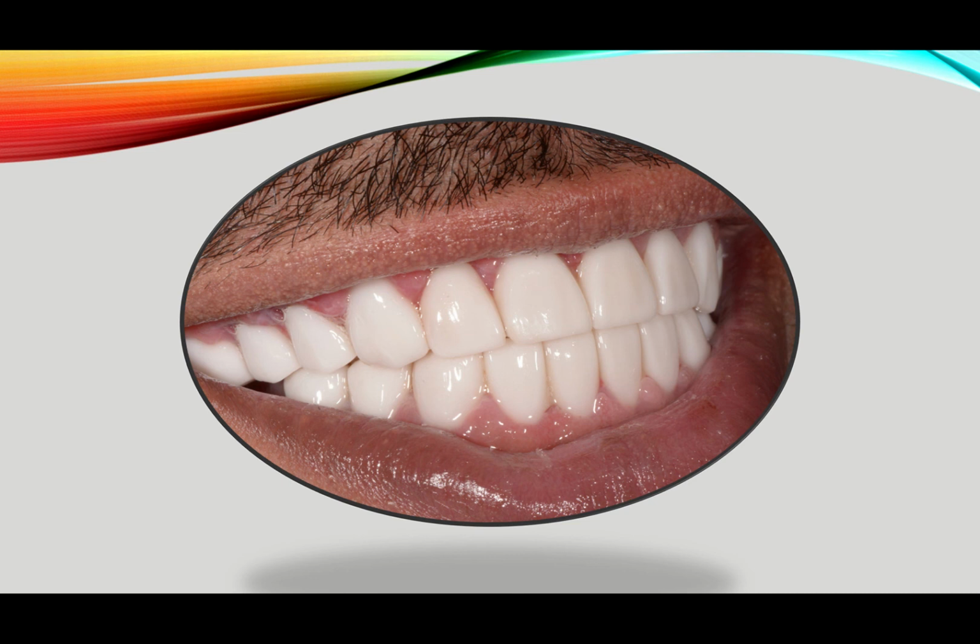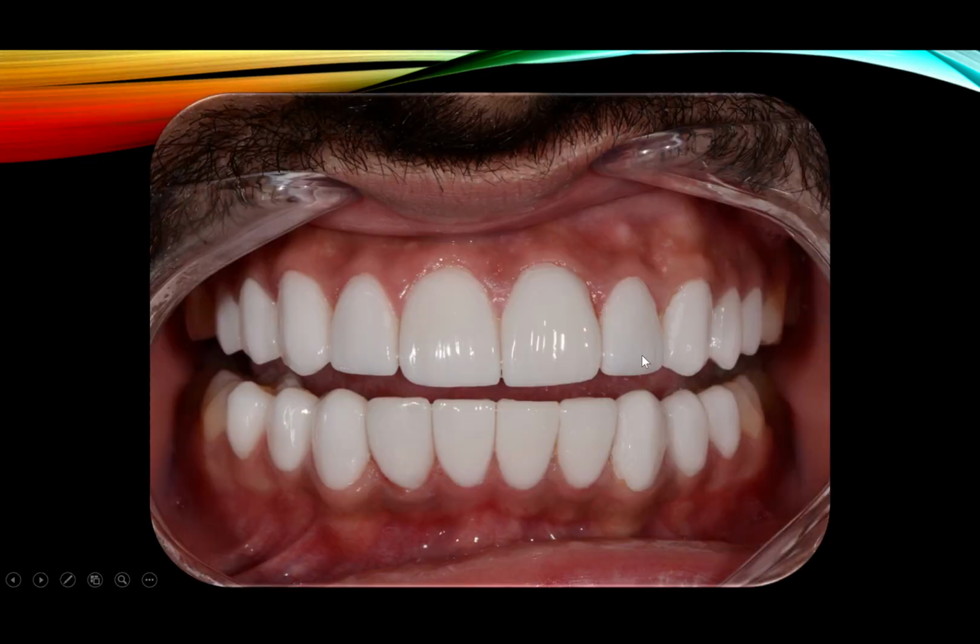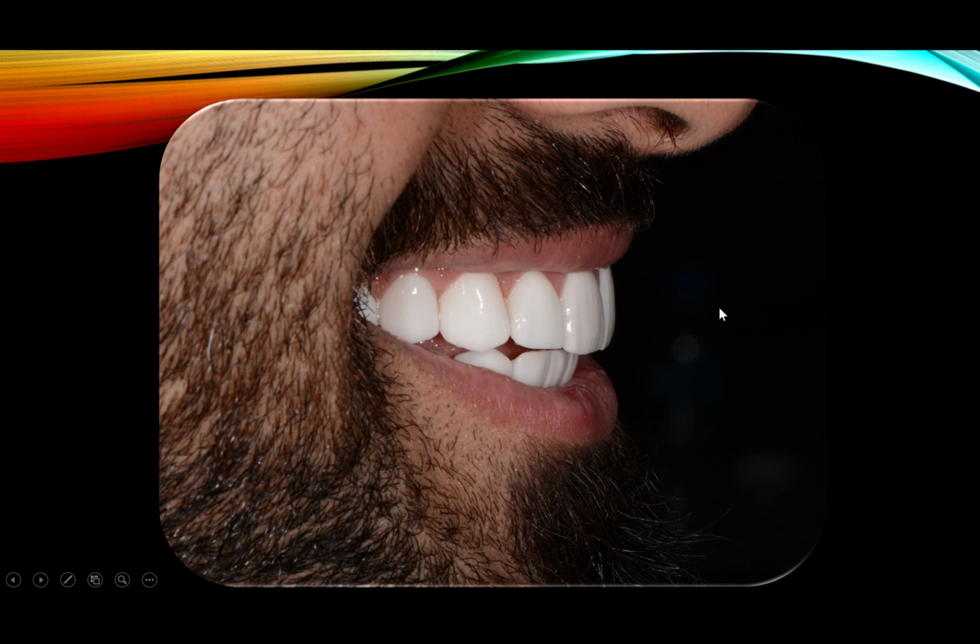Bleach 3, all right. Bleach 3 case, same thing. Bleach 3 a little bit more yellowish than bleach 2 and bleach 1. But still, you do the whole mouth in just veneers, and maybe one crown on the molar, something like that. But yes, super white, no translucency, nothing. The super white guy, the BL0 guy, same thing, shells, veneers, 0.5 millimeters, all pressed, all monolithic, only glazing.